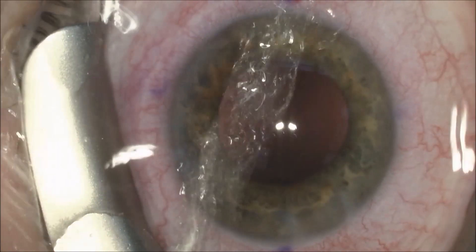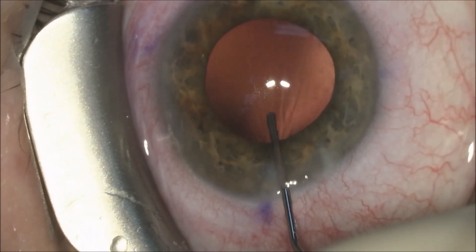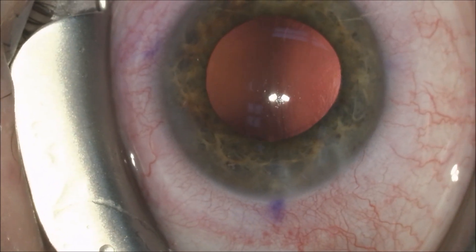we will do our usual capsule polishing with a 27-gauge cannula on a balanced salt solution 3 cc syringe.